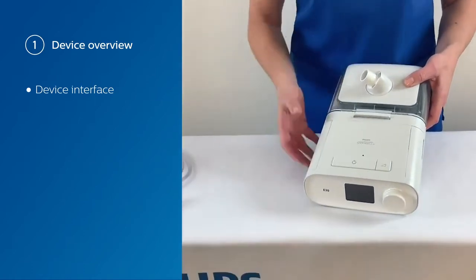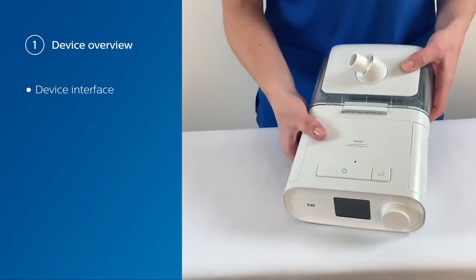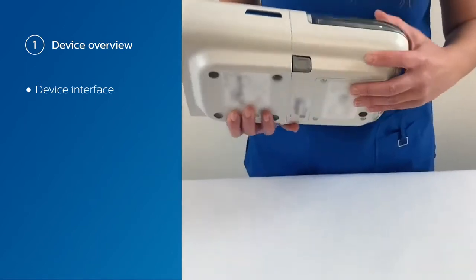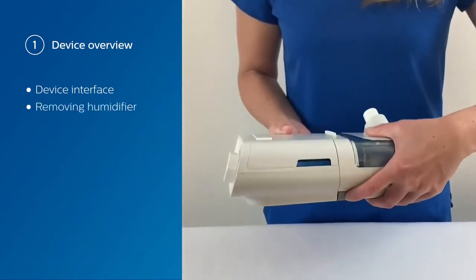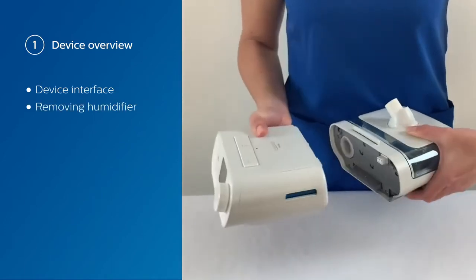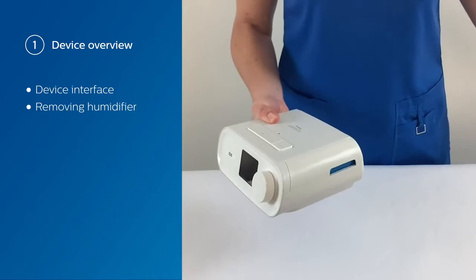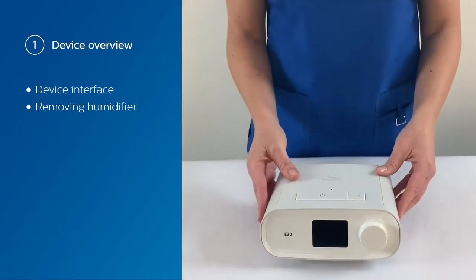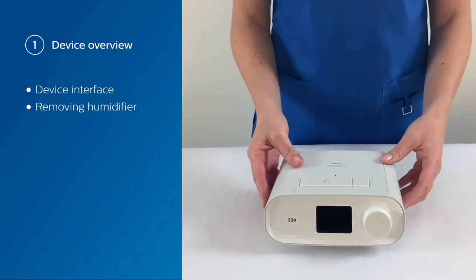You can also see that it comes with a humidifier installed. The humidifier is meant for a non-invasive patient. What we're going to do here is actually remove the humidifier — simply press the button, gently pull apart, and put that humidifier aside. If you're going to be using the device invasively, make sure you use an external humidifier or an HME.